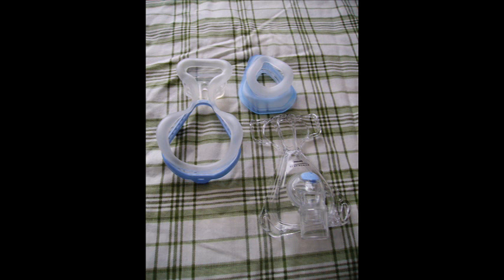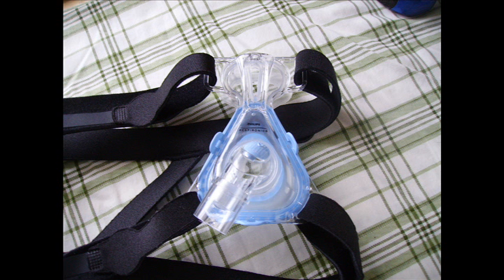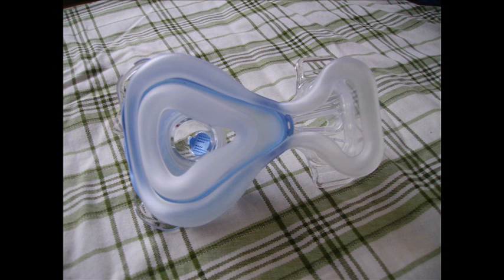Both of these masks don't leave any mask lines from the headgear on my cheeks at all. So these are two great pieces of technology. Let's look at them in action.